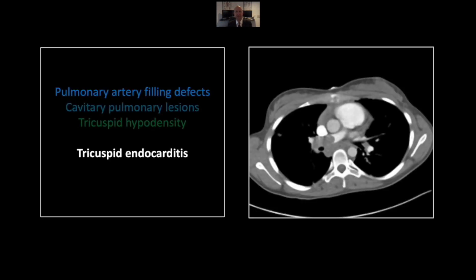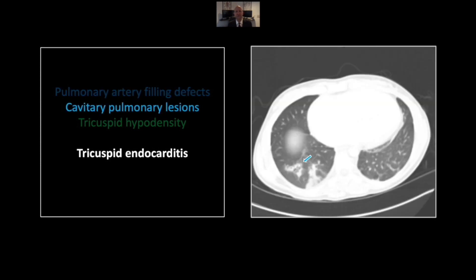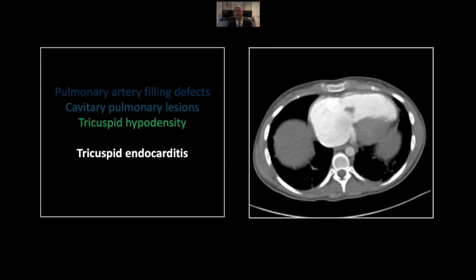Our next case is tricuspid endocarditis, with septic embolization and tricuspid valve insufficiency — two common complications of this pathology. You see here a large mass of vegetative matter occluding the right pulmonary artery, fairly unusual to see it to this degree. Downstream from that on lung windows you can appreciate small cavitary lesions and wedge-shaped peripheral parenchymal densities, highly suggestive of pulmonary infarctions. On the soft tissue windows you can actually appreciate a tricuspid vegetation. Note also there is right atrial enlargement and hepatic venous backflow, both suggestive of tricuspid insufficiency.